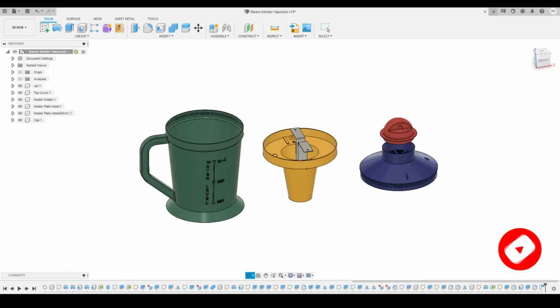Then I will click on finish sketch, then activate my revolve tool again, and by default the profile is not selected because there are multiple profiles. So I have to select the profile, and then specify the axis. I will click here and then specify the axis. This vertical line is the axis, and by default it gives me a 360 degree angle of rotation. I will press OK to accept the result.